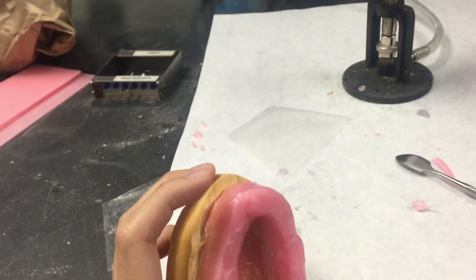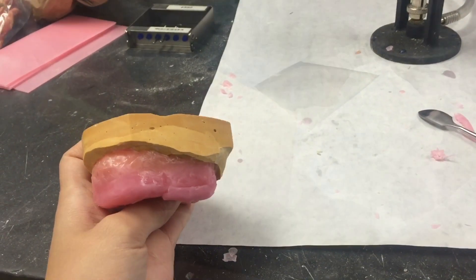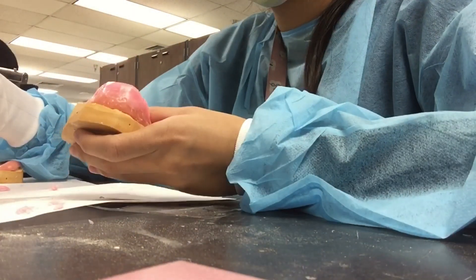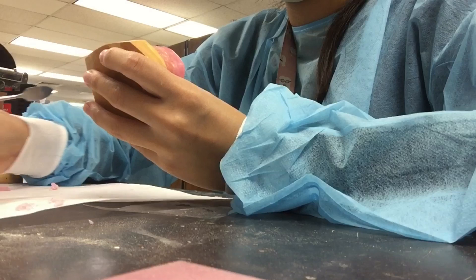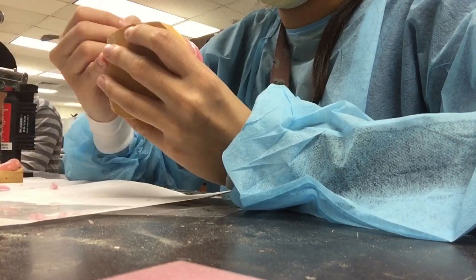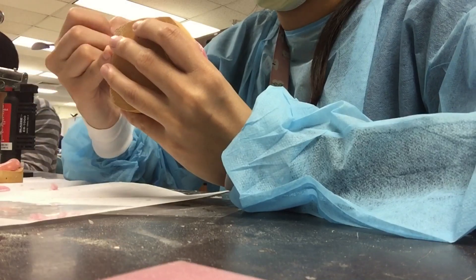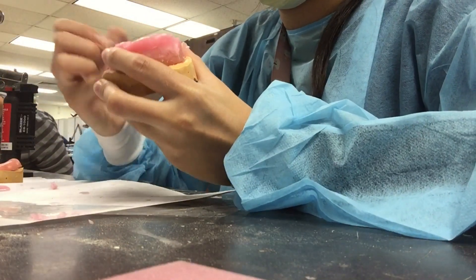Then I add a lot of wax on top to create the wax rims. The whole point of the wax rims is they act as a guideline and a blueprint for the patient's bite. Basically I build up these blocks of wax, and when I put them in the patient's mouth I can adjust them to match their bite.